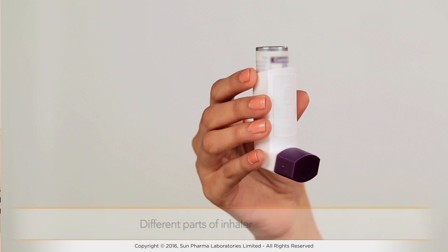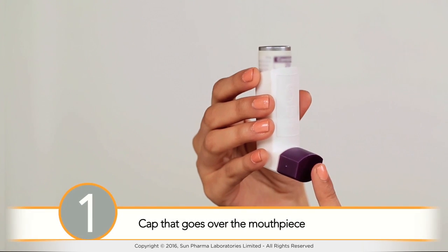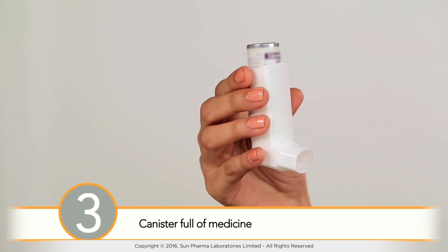It is important to know the different parts of your inhaler to use it efficiently. Usually, metered dose inhalers have three parts: a cap that goes over the mouthpiece, a mouthpiece, and a canister full of medicine.